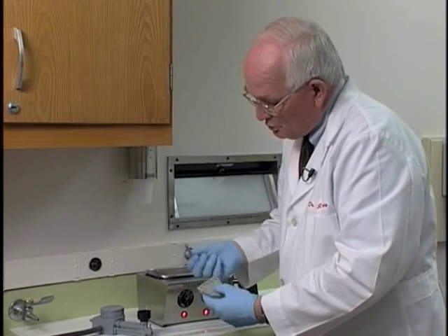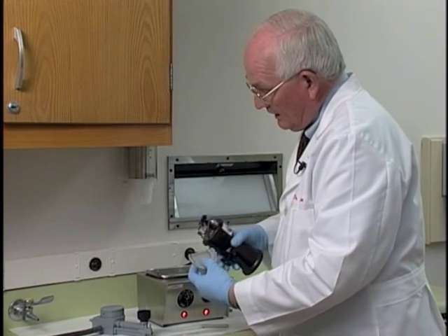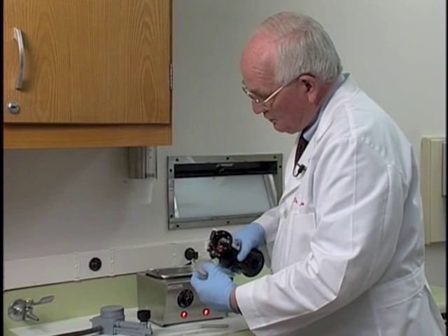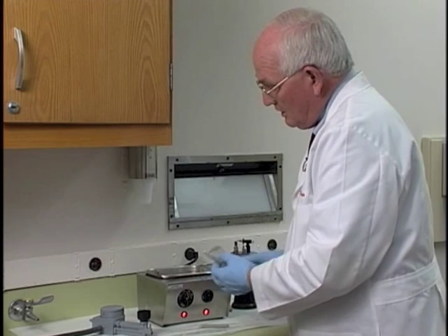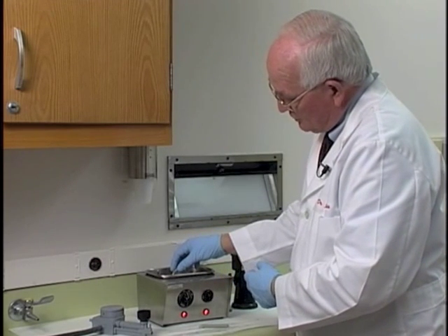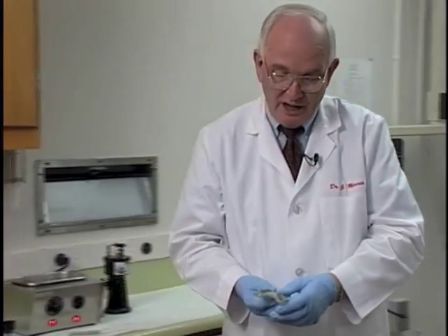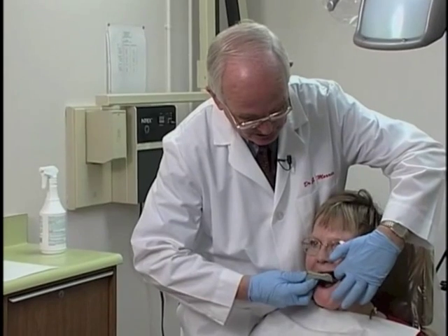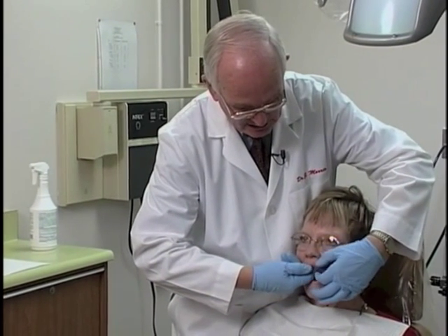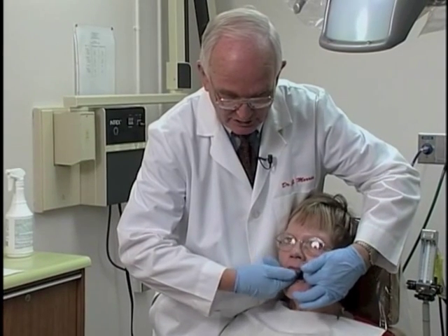Add compound to the tissue surface of that. And now what we're going to do is just superheat that material. We don't even need to build it up with our fingers like we did with the other sections of it. We temper, and then we go to the mouth. And the only thing we do with it this time is to seat it and put a little pressure posteriorly on it so that it will displace some tissue.